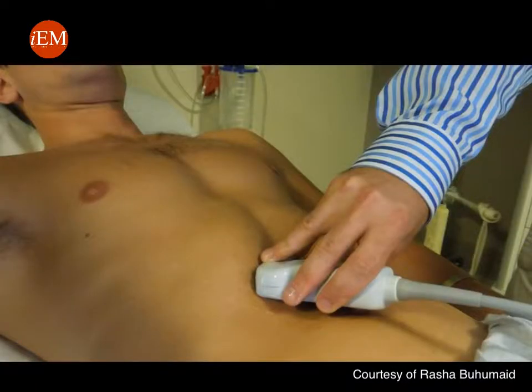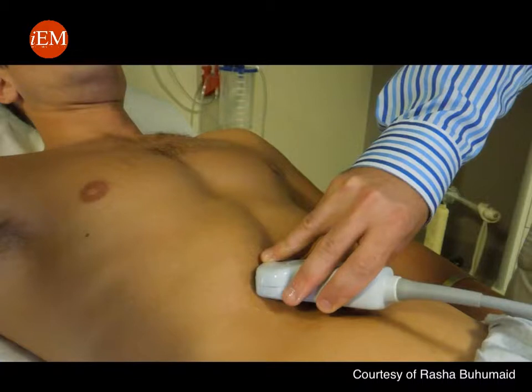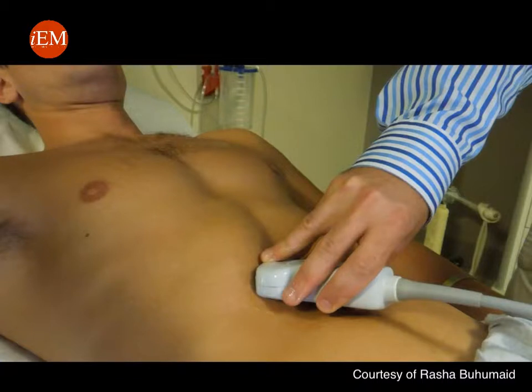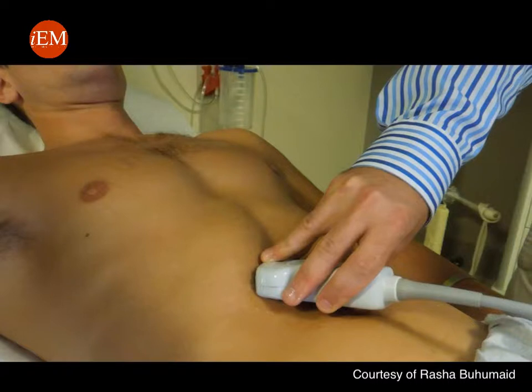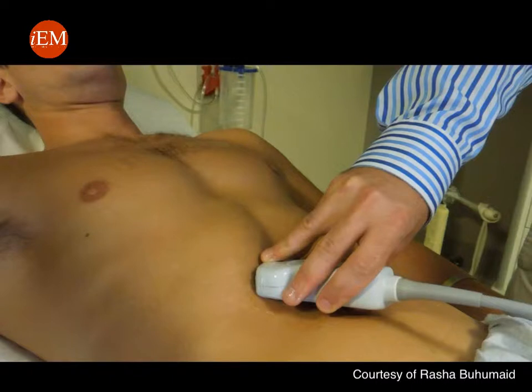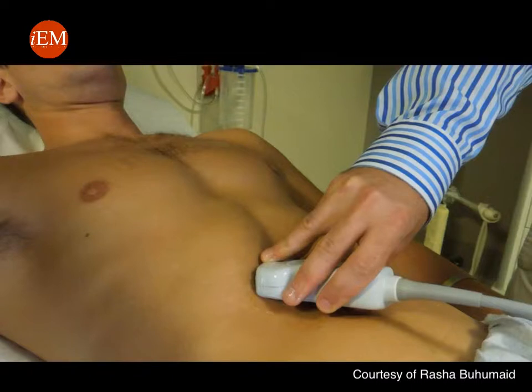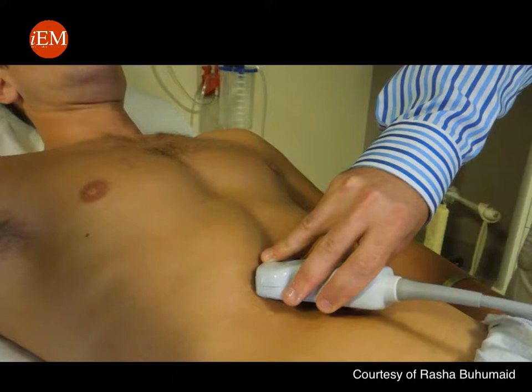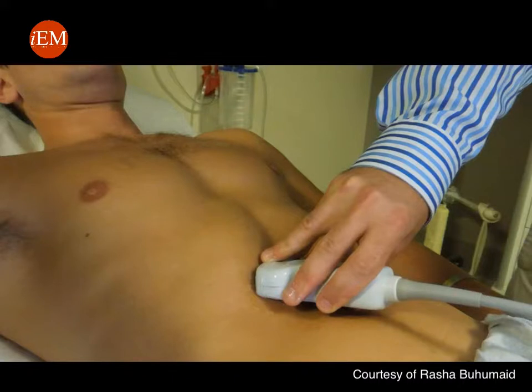Your anatomical landmark to start scanning the IVC will be the sub-xiphoid process. First you will obtain a sub-xiphoid view of the heart as discussed in the basic echocardiography videos. You will have the probe marker towards the patient's right and have the probe placed flat below the xiphoid process.